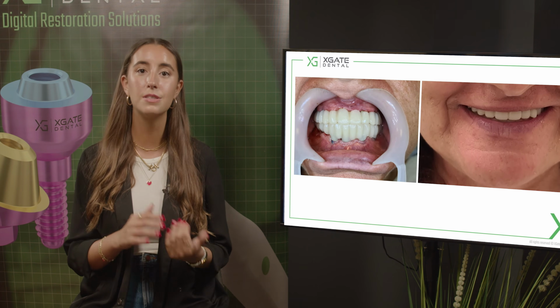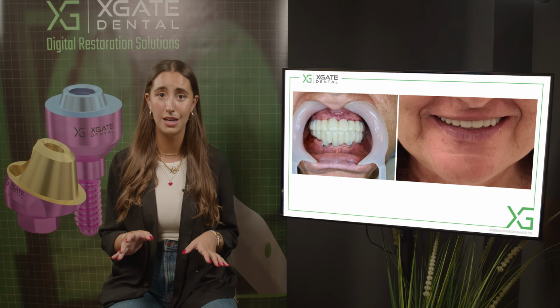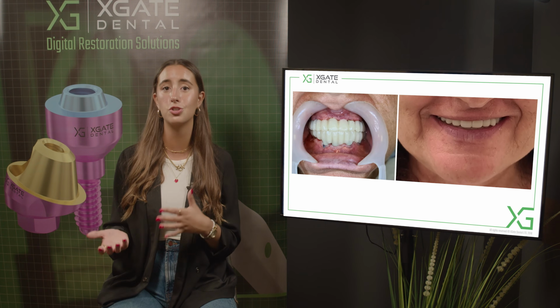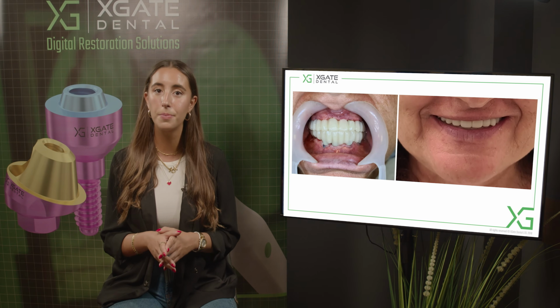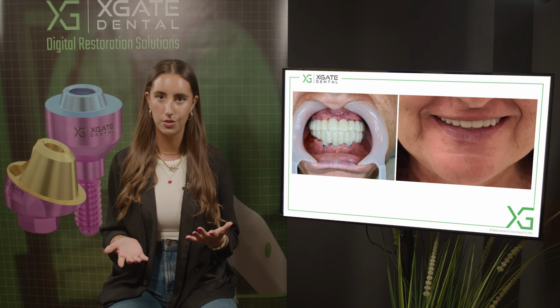This bridge, when she smiles, you can see the upper teeth. The incisors are almost the same size. With implants, sometimes it's difficult to have the same size of the incisors because on one of them, she had a long crown, and on the second one, she had a short crown. And you need to compensate for all the things that you had before. And the same thing for the implants on the lower jaws.